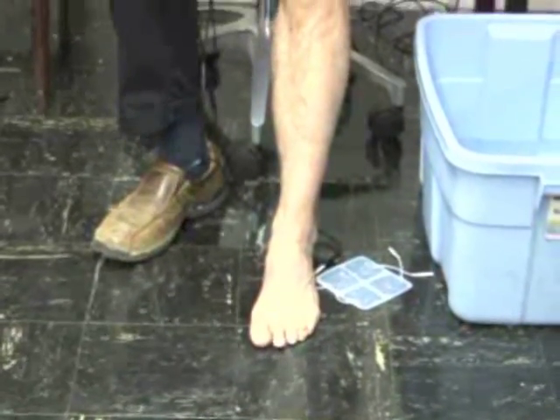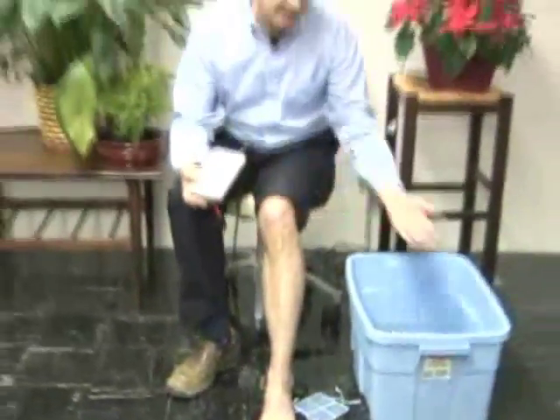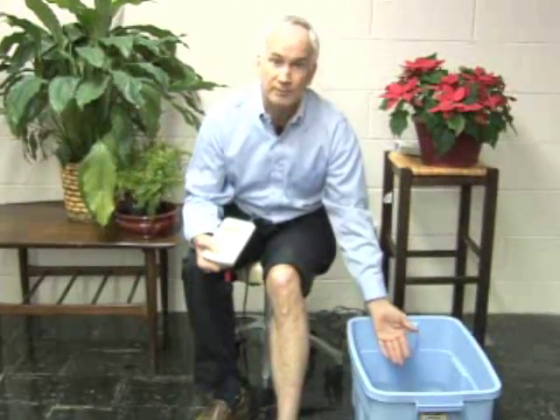So one of the things we would do with the water — in most situations it would be warm water, trying to increase blood flow and other things. But some patients it may be best to use cold water. This particular gentleman, when he's walking around his feet are fine; it's when he stops that the pain comes. One way he's found relief is taking his shoe off and putting his foot on a tile floor, which is cool. So to him we would say: when you put your foot in the water to do a water treatment, make it cool water. For most of you, it will be warm water.